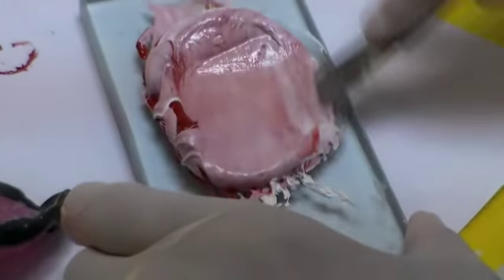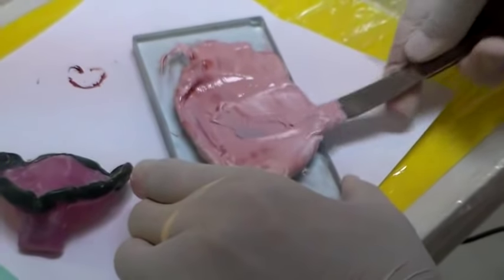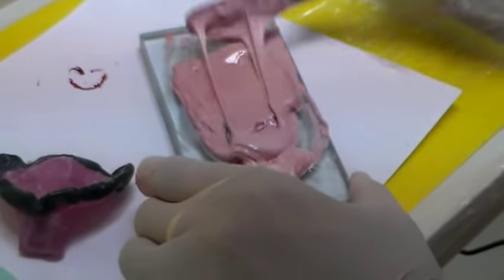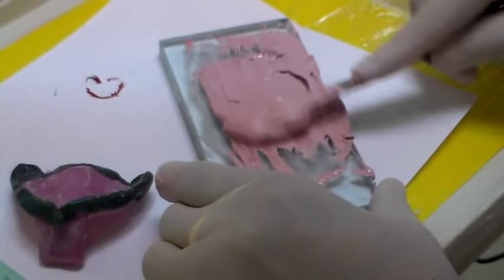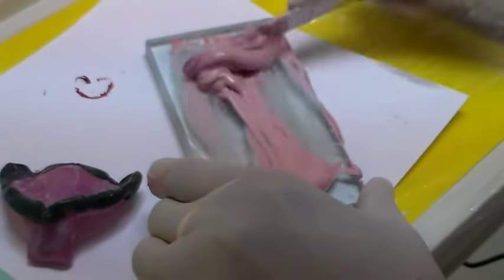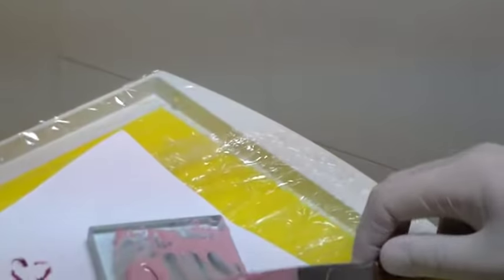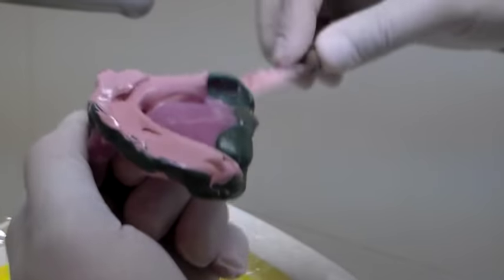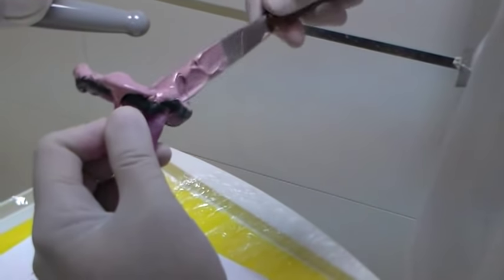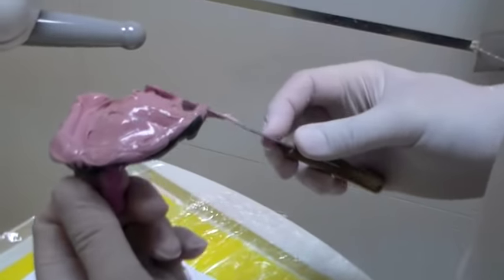Using a glass slab and an impression spatula or a flexible flat-bladed spatula. Once you don't have any more streaks in your mix, you can start loading. You want to load it from the sides. I like to load it onto my borders, then onto the body of my tray.